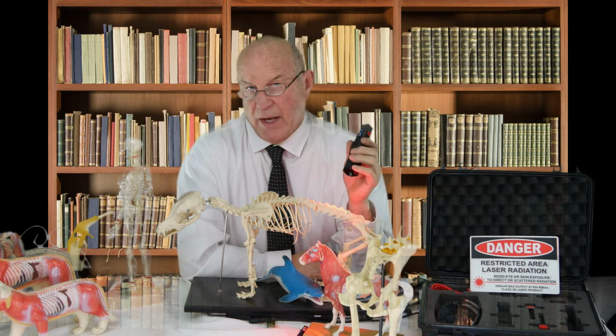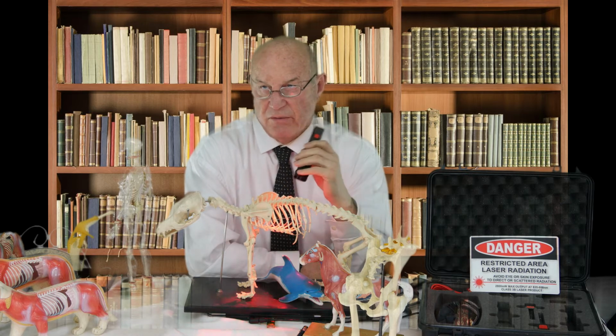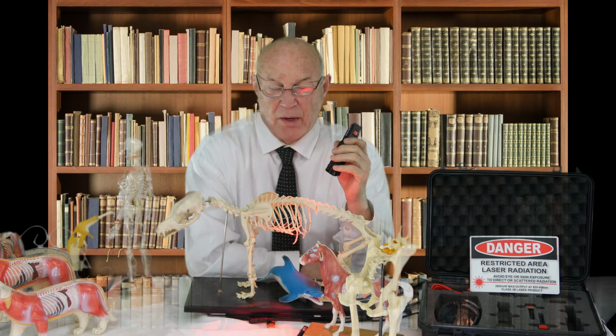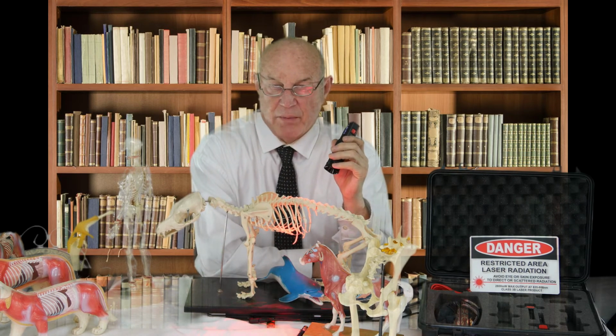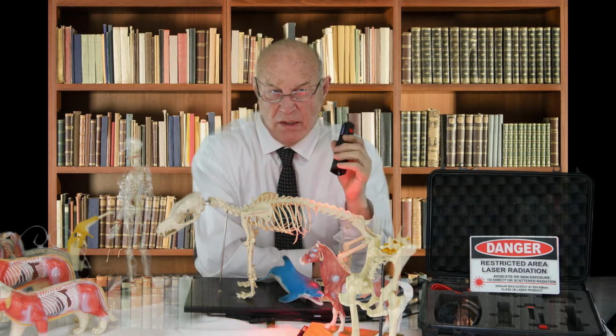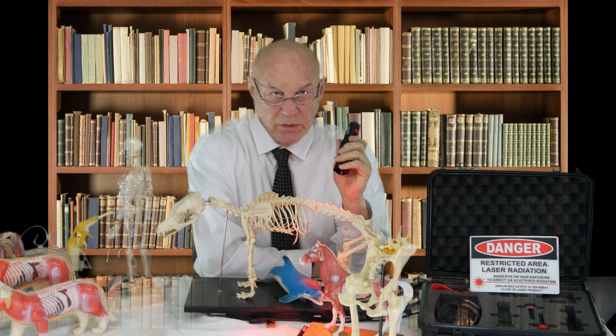One of the first things to come back is deep pain, and so when we're lasering, we see these animals start to give us deep pain, and when we have paresis or paralysis, that's a good sign. And we're right on track. After about 3 or 4 weeks of treating with the laser at least twice a week, if we don't see any response, there may not be neurological tissue that's rehabilitatable.